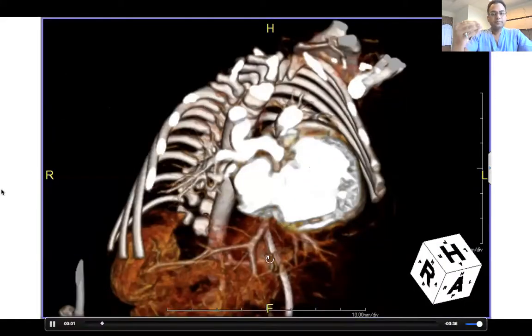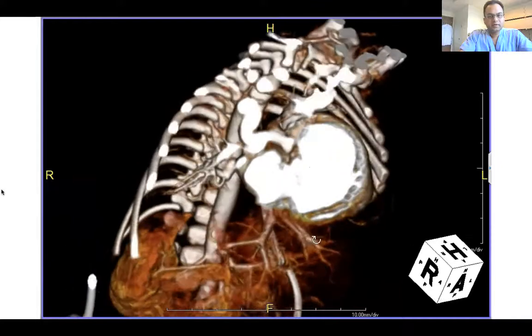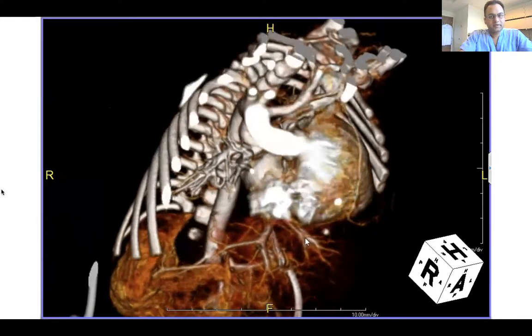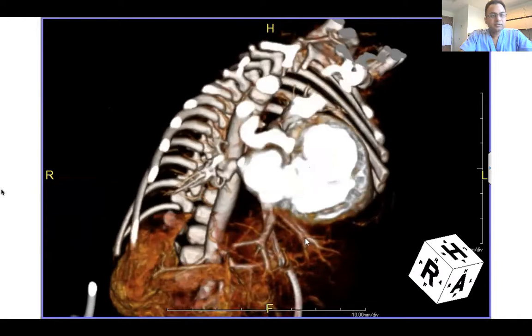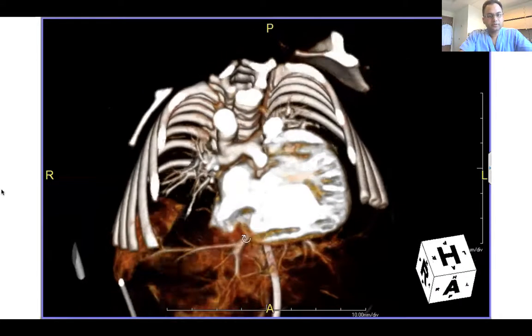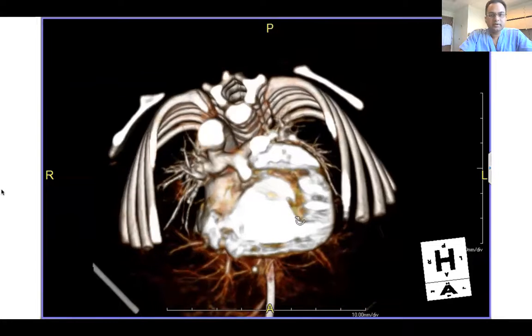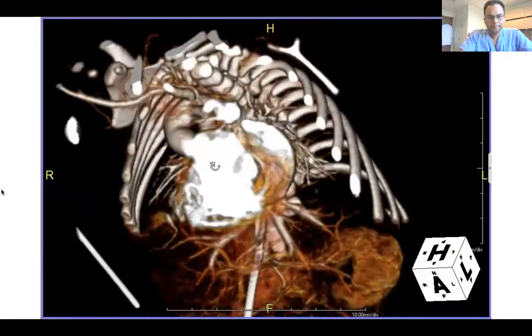We show you the same patient with a 3D reconstruction, which you can rotate. It's very easy to understand that this patient probably has a right aortic arch with mirror image head and neck branching, and there is a large tortuous ductus arteriosus which rises from the underside of the arch and feeds the confluent bilateral branch pulmonary arteries, as you can see there, with mild hypoplasia of the right pulmonary artery.